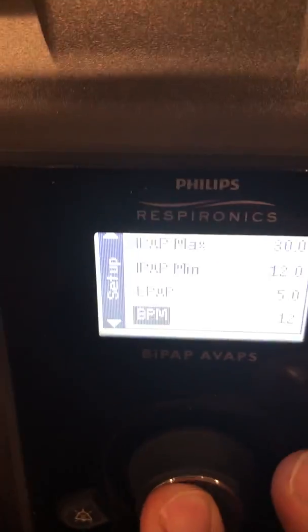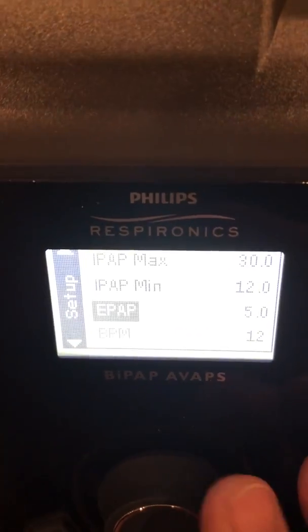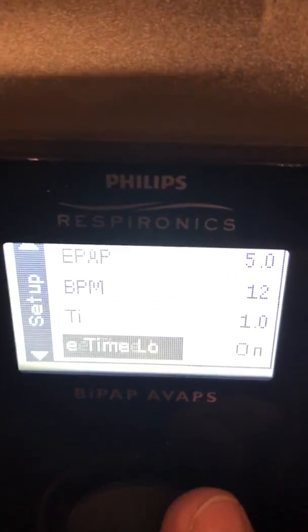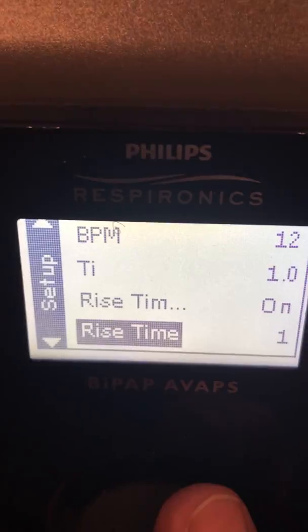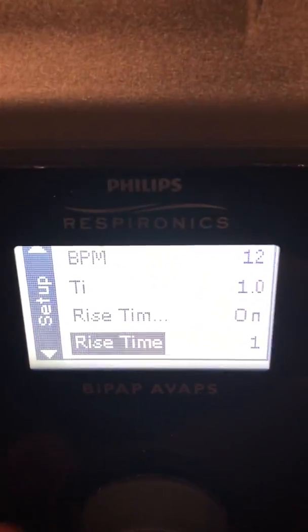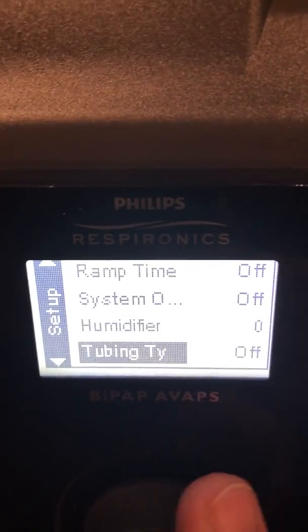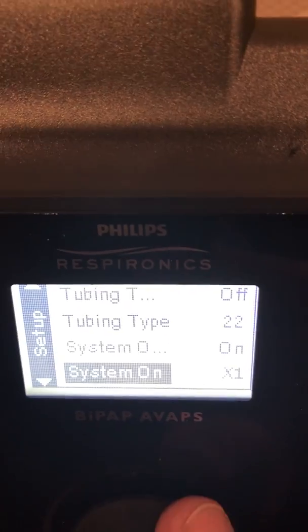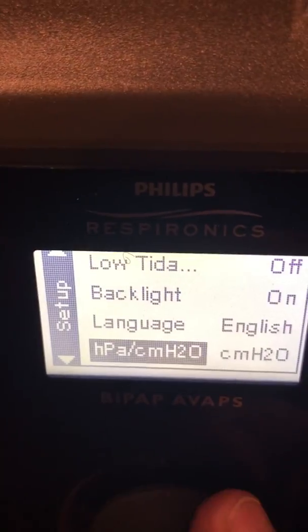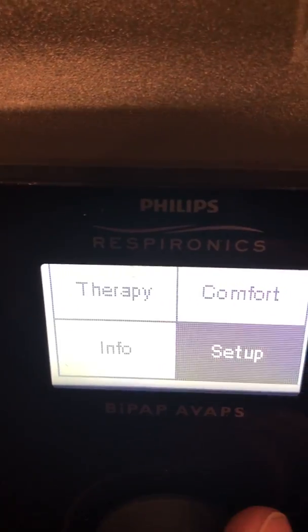Breath per minute — here's our breath rate. We're going to select that and keep it at 12, push, and toggle back. Going down, these are i-time and other assorted settings. Rise time is on. Those are all the settings we were going to make at this point for the sake of demonstration. I'm going to keep going down until we get to the back option and select that to return to the menu.